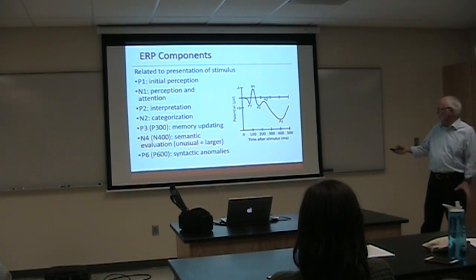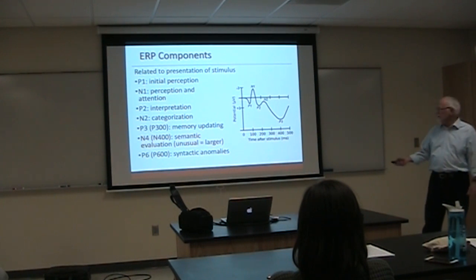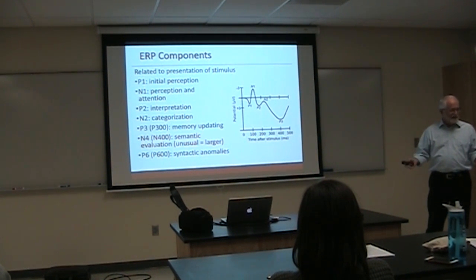So once again, I don't have it on this thing. Here we see a P300, which, why do we call it P3 if it's over the 400? Because you can see the deflection starting at around 300, and then often it reaches its greatest deflection at about 350 or 400, but we still refer to it as the P300. By the way, P3 and P300 are basically the same thing.